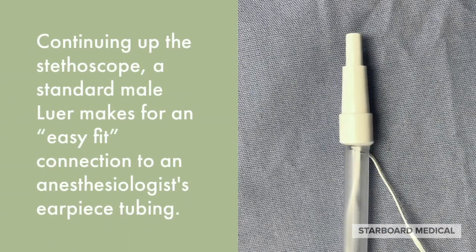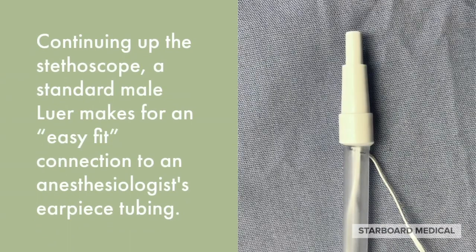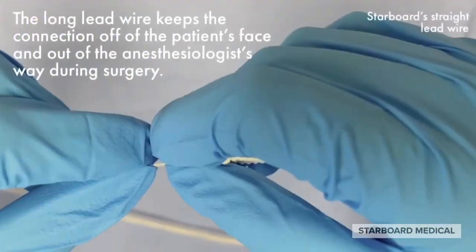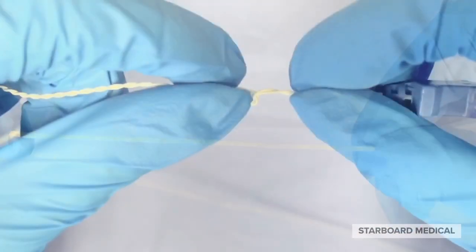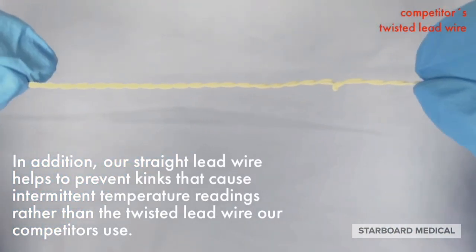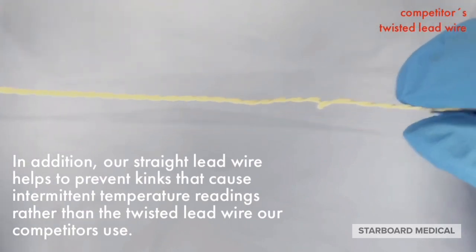Continuing up the stethoscope, a standard male luer makes for an easy-fit connection to an anesthesiologist earpiece tubing. The long lead wire keeps the connection off of the patient's face and out of the anesthesiologist's way during surgery. In addition, our straight lead wire helps to prevent kinks that cause intermittent temperature readings, rather than the twisted lead wire our competitors use.